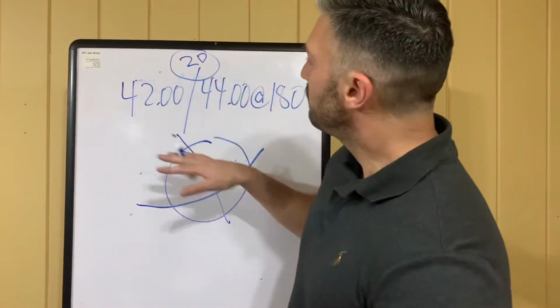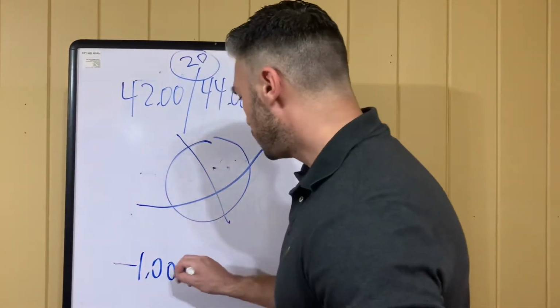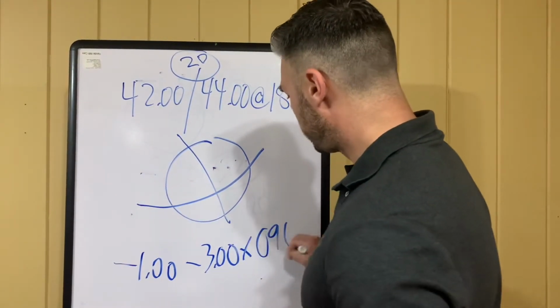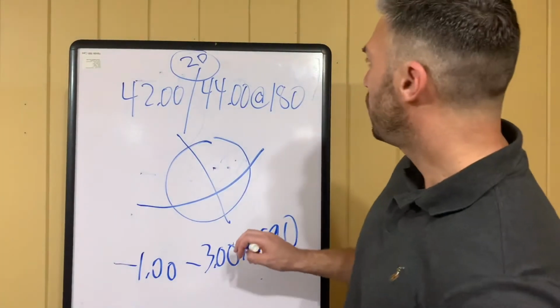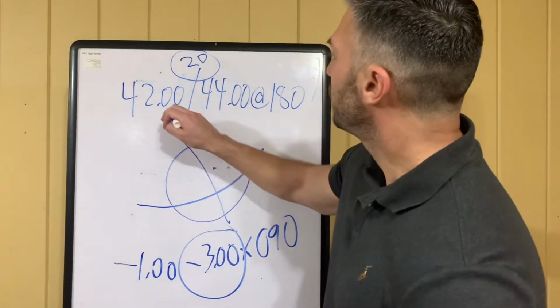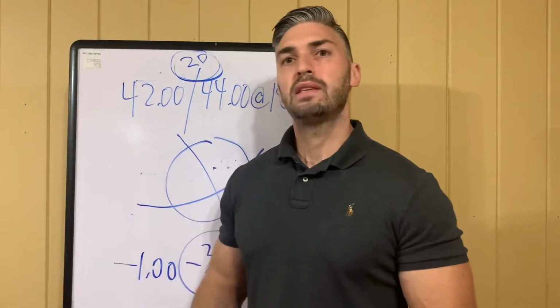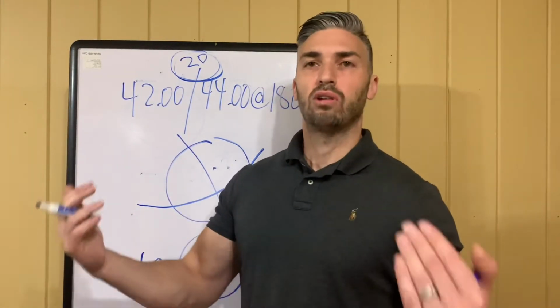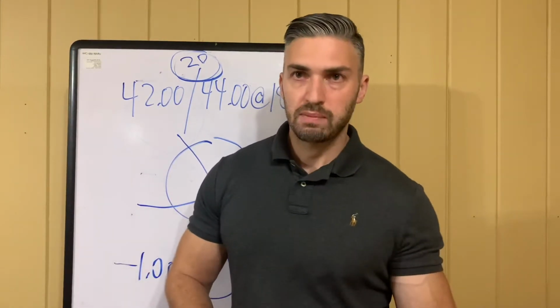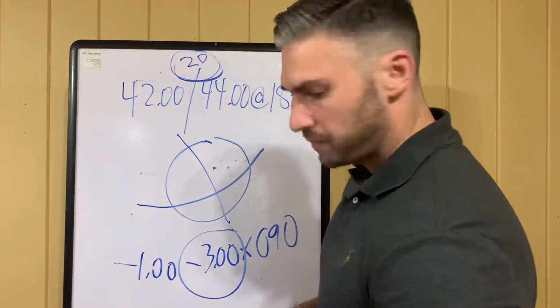So what this means, when you take that into effect with the prescription, let's say your prescription is -1, -3, axis 90. If this is showing that there's 3 diopters of astigmatism and your K readings are revealing that there's 2 diopters of astigmatism on the cornea, that means that there's 1 diopter of lenticular or internal astigmatism. That's going to be important to know, the difference between corneal astigmatism and lenticular or internal astigmatism, as you work through these problems.